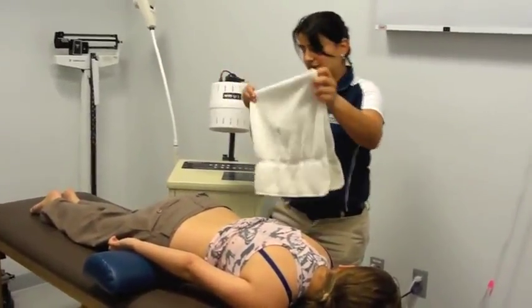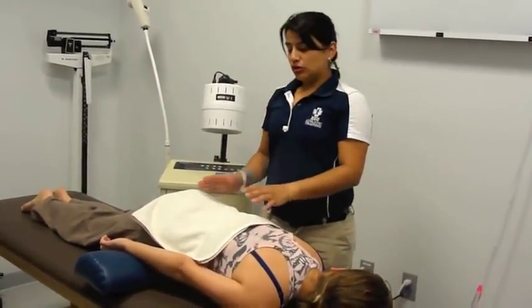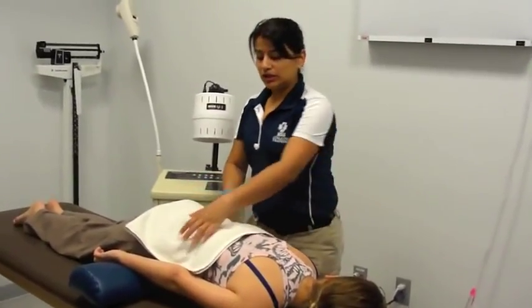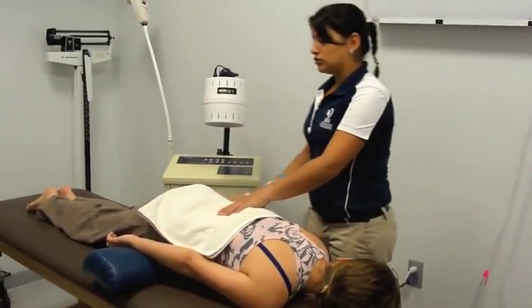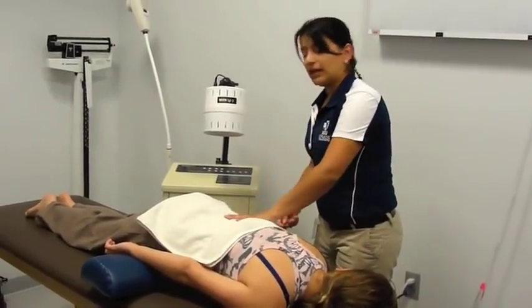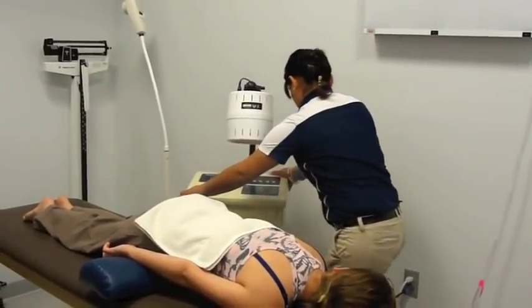Now, the second part, when we're treating the low back, is to expose the area. Now we have to put a towel. This is used first so the moisture coming out of the skin can be kept in the towel, and also to prevent any burning. So now we're going to set up the machine.